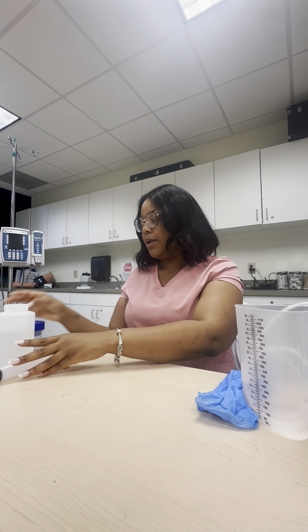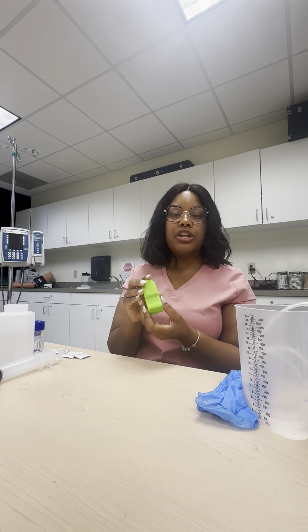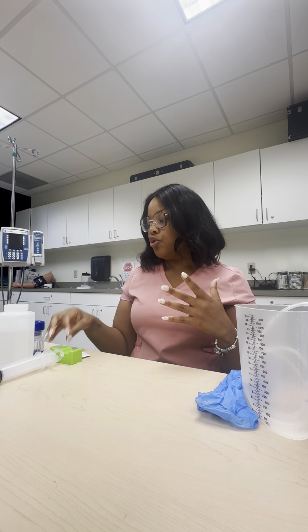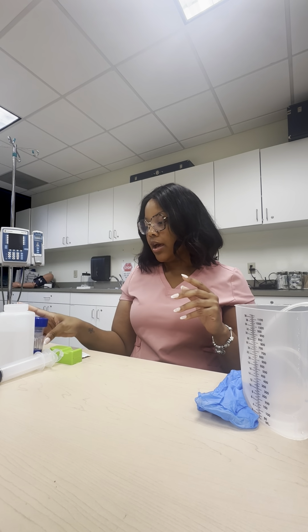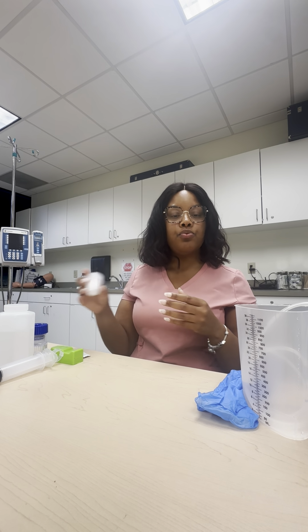All right, so then you want to get your pill splitter in case you have to give a half a pill. You want to get your pill crusher because it's going through the peg. So you're going to have to crush the medications. You want to get your medicine cups. You want to get your gloves, and you want to have your hand sanitizer for hand hygiene.